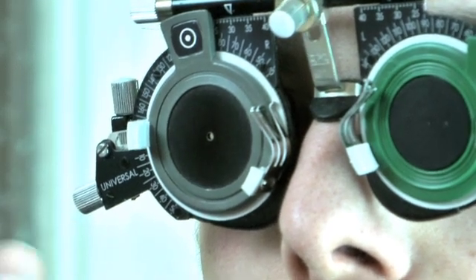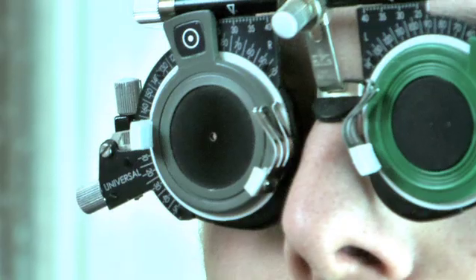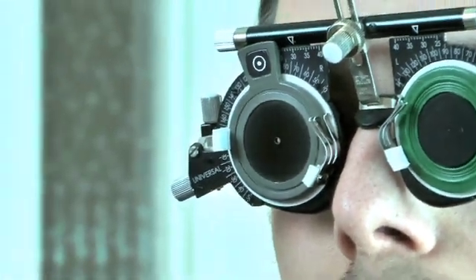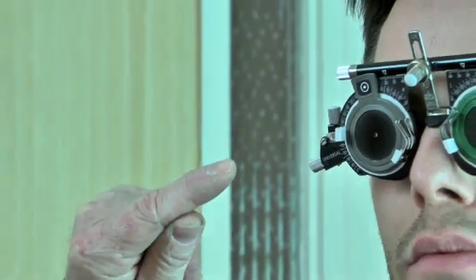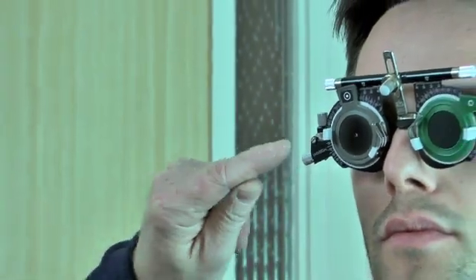So it's a very important test, because the pinhole will identify refractive error. If, looking at the chart, he can see a little bit better with the pinhole, it means that we can improve his vision with glasses.